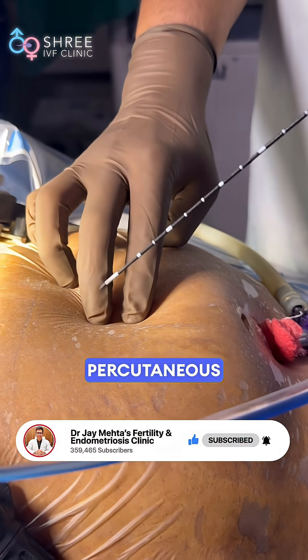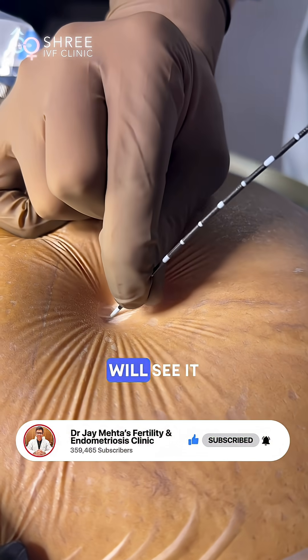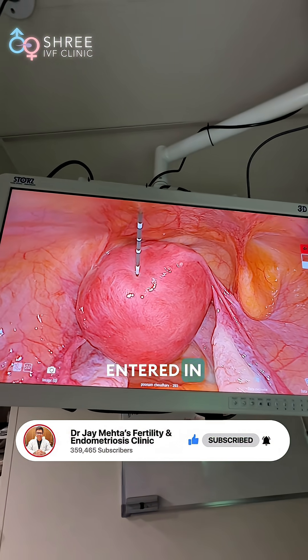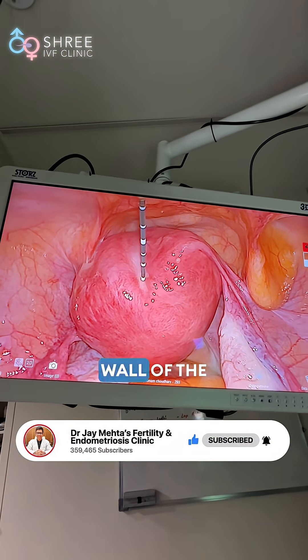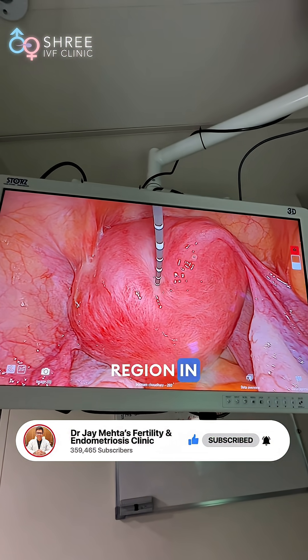Only this percutaneous probe goes into the abdomen. It has gone through the skin and we will see it in the abdomen now. The probe has entered and is going into the wall of the posterior adenomyotic region of the uterus.